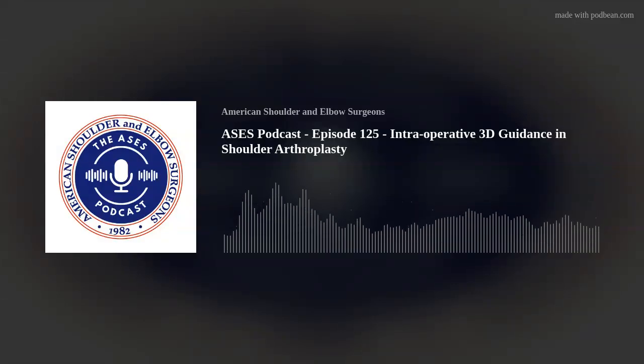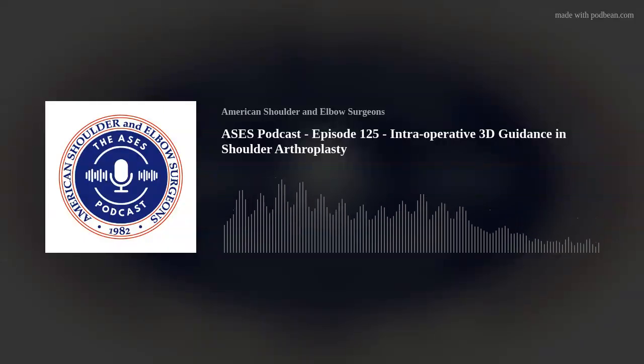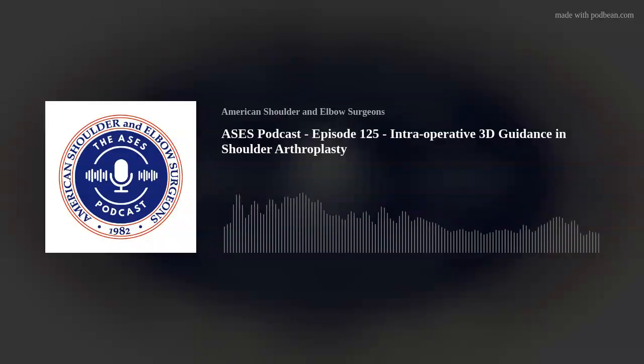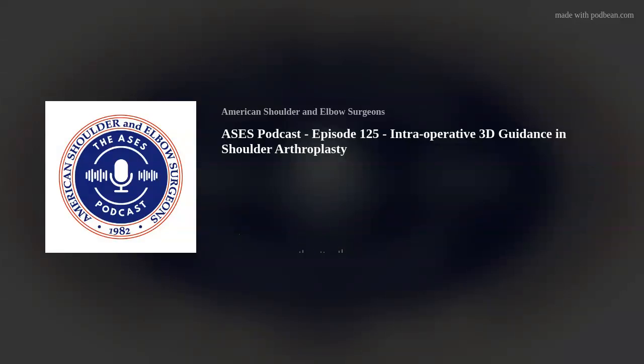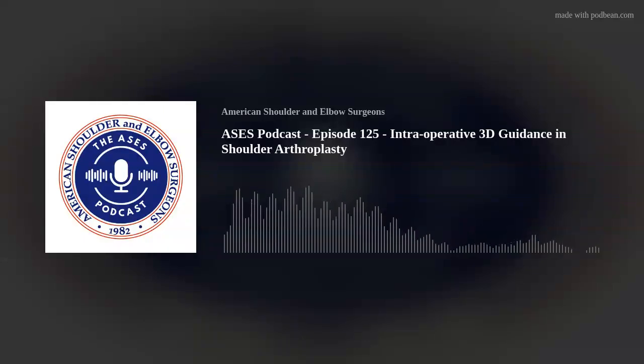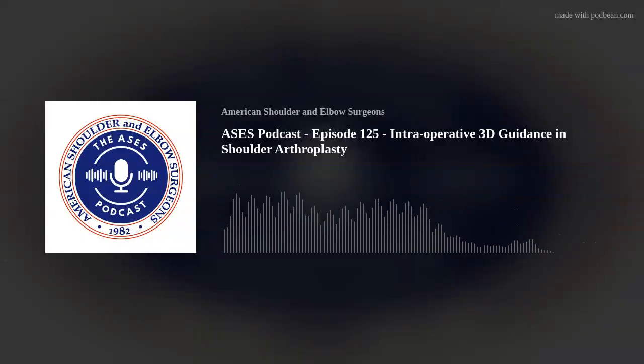Tom, any differences there? No, pretty similar for me compared to what Brad said. I'm usually shooting for neutral version whenever I can. It's pretty rare that I'll deviate from that with the implants we have, like augmented base plates now. It takes a pretty substantial bone deficiency problem or some other unusual thing, like a dysplastic glenoid, for me to deviate from neutral scapular version.